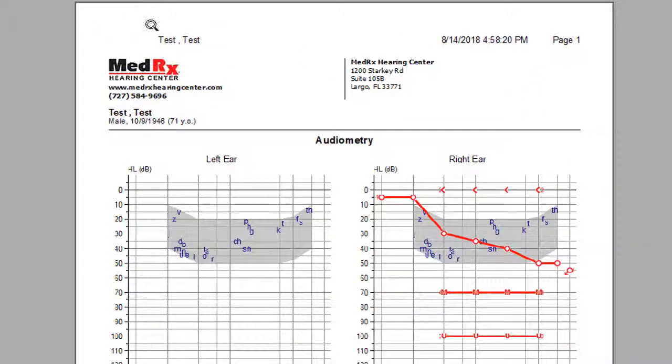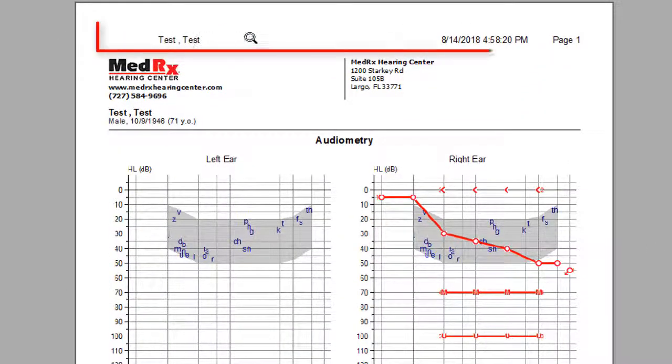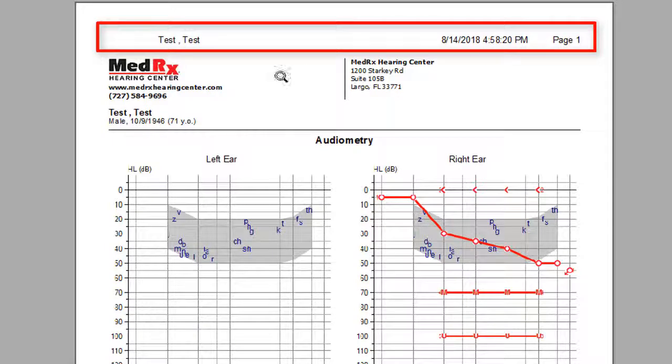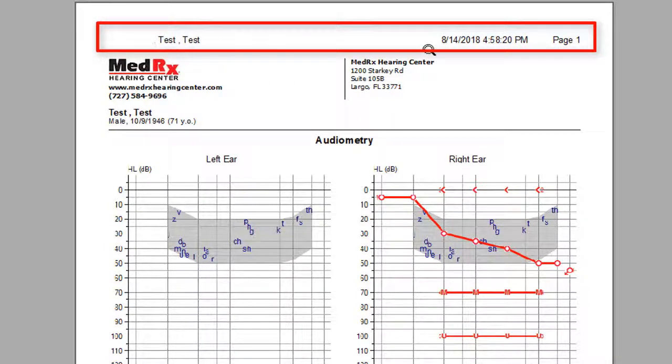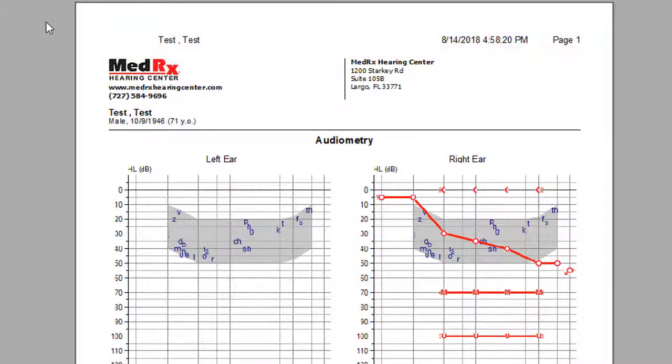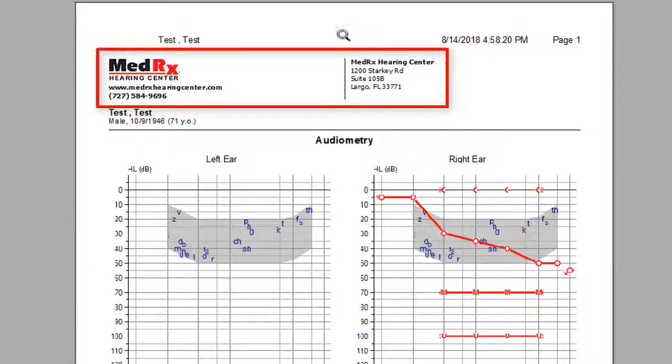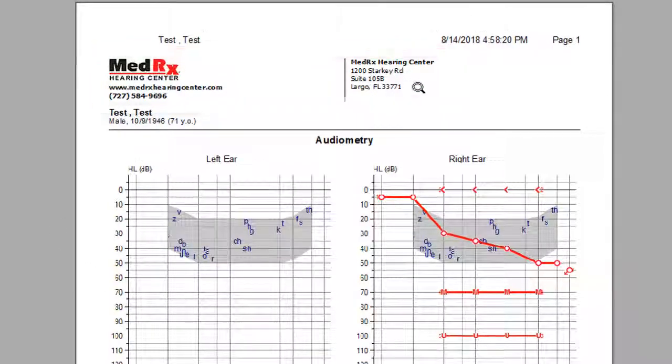At the top here, we have the patient information. So test test is the patient name with a timestamp and date. We have customized this to have MedRex Hearing Center address.